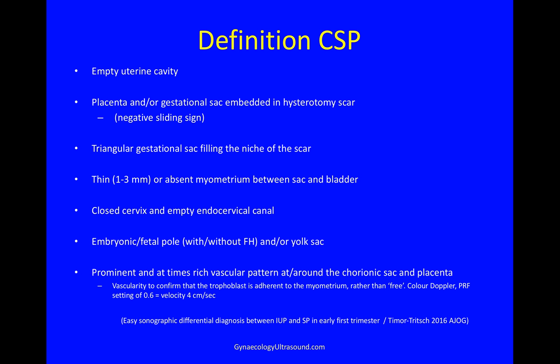The vascularity confirms that the trophoblast is adherent to the myometrium rather than free. You use colour Doppler at a PRF of about 0.6, which is equivalent to a velocity of 4 centimetres per second.